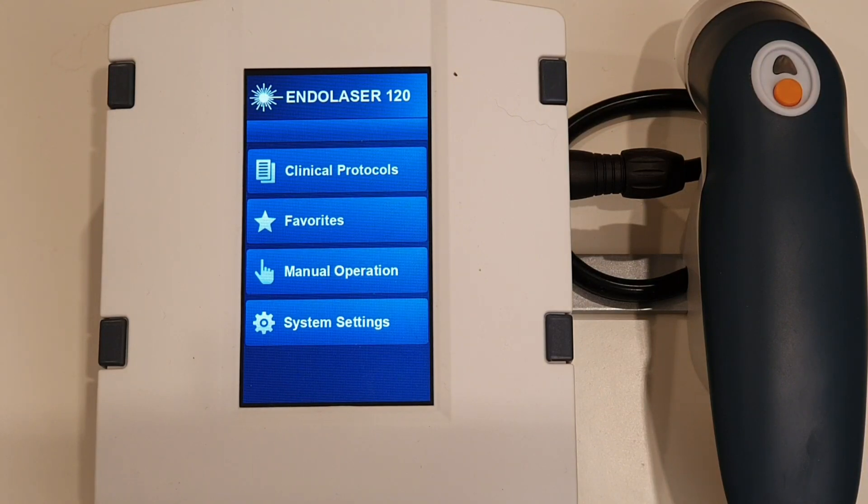Today I'm going to be treating the knee with the Endolaser 120. I'm using a cluster probe — this is a four-point cluster probe, 400 milliwatts, although I won't be using the full 400 milliwatts; I'll only be using 200 milliwatts today.